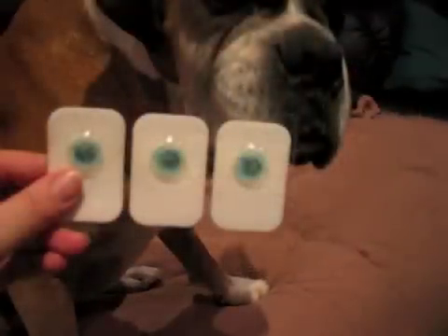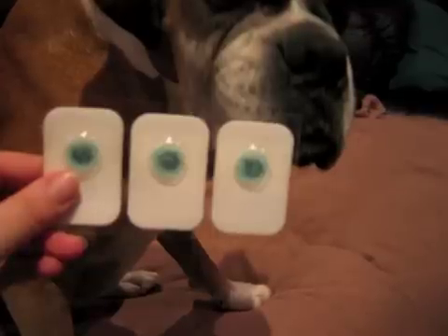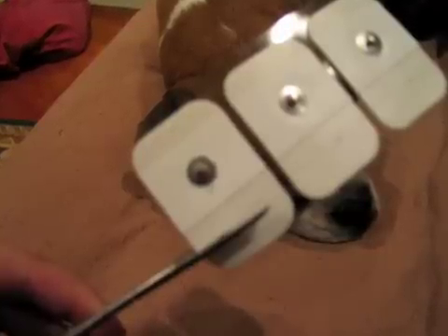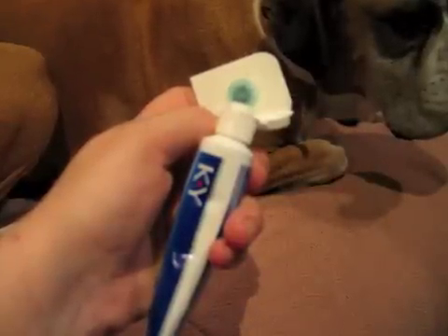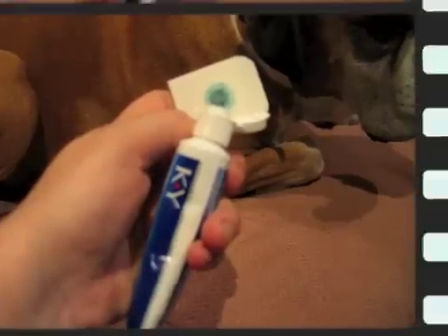The other side of my electrodes has a dollop of gel on it. Some electrodes would look a little bit different. For the type of electrodes I have in my kit, I trim them — they're way too big and it means there's a lot more sticky residue left on the dog. I also add a little bit of KY jelly or an ultrasound gel just to improve the conductivity.